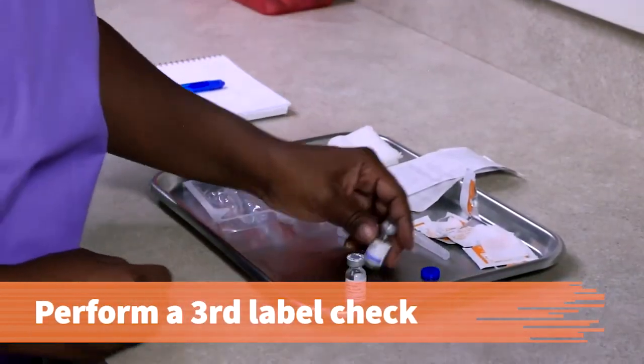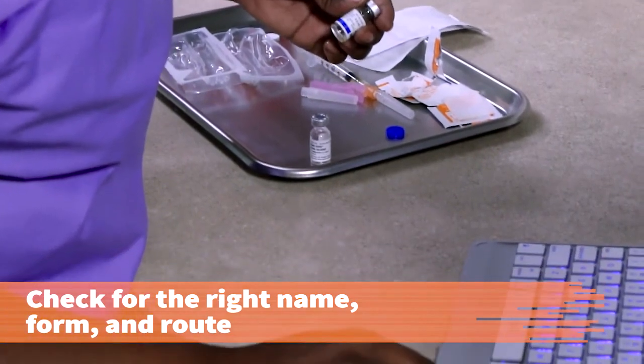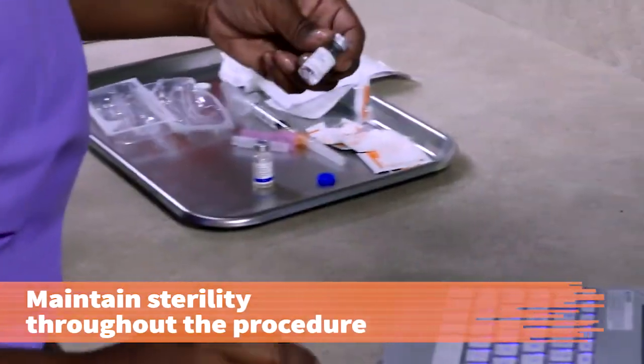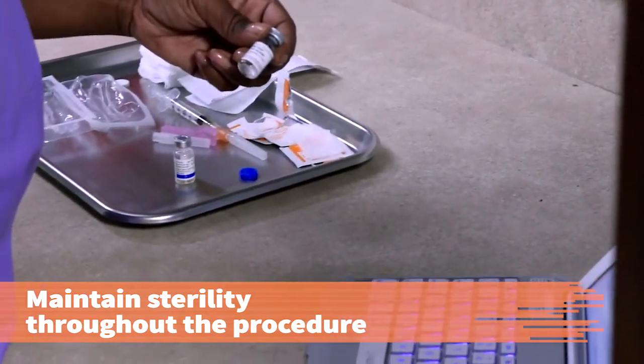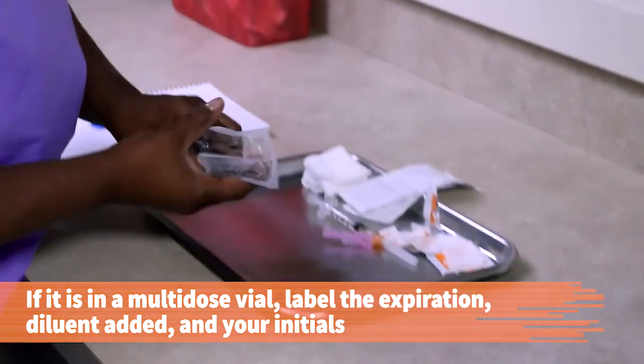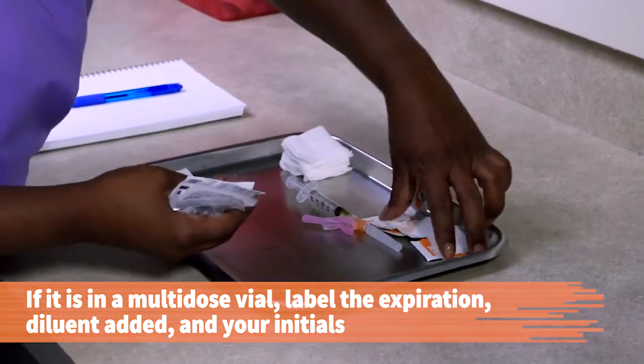Perform the third medication label check. Compare each medication label to the order. Check for the right name, form, and route. Maintain the sterility of the medication and the needle throughout the procedure. If medication is in a multi-dose vial, label the expiration date, diluent added, and your initials.